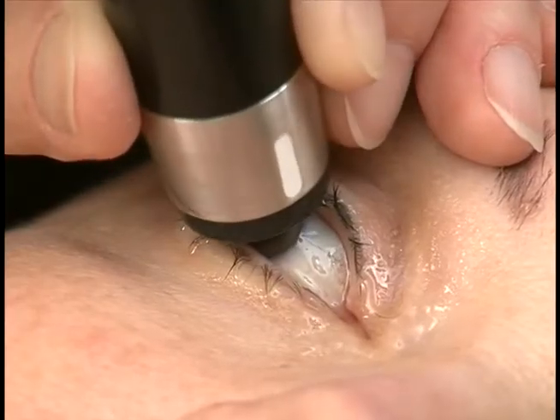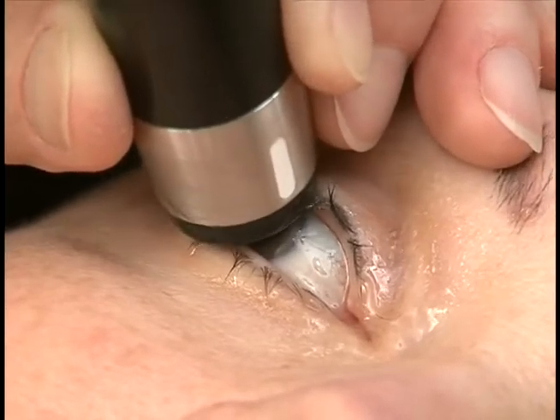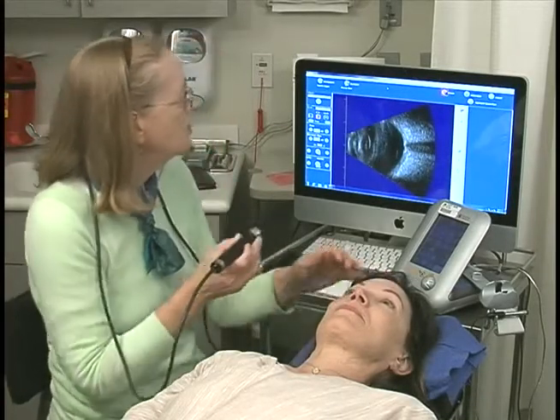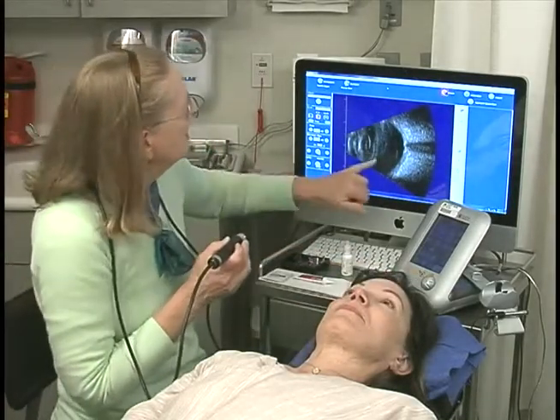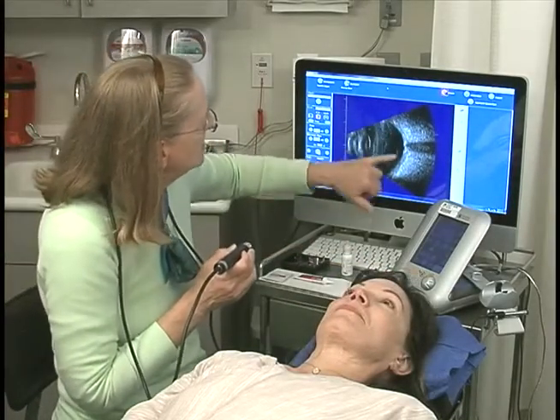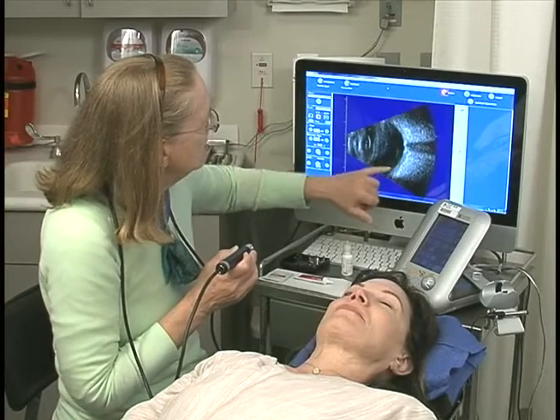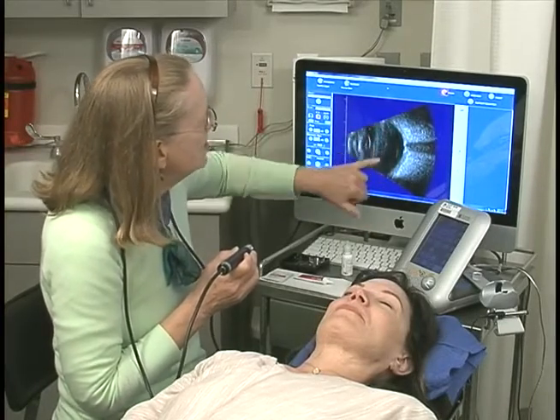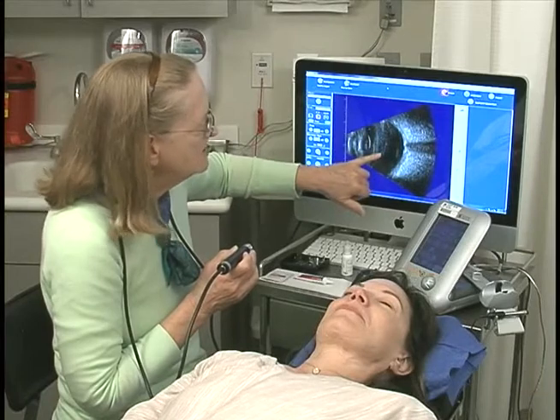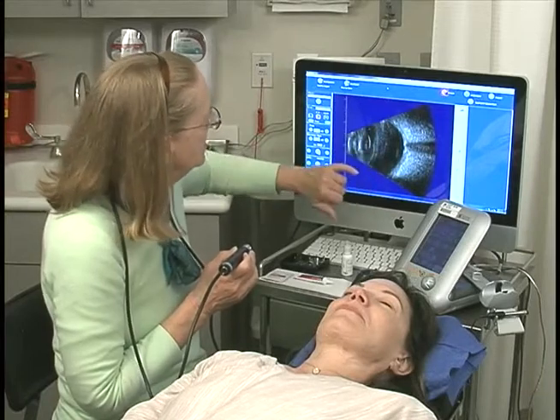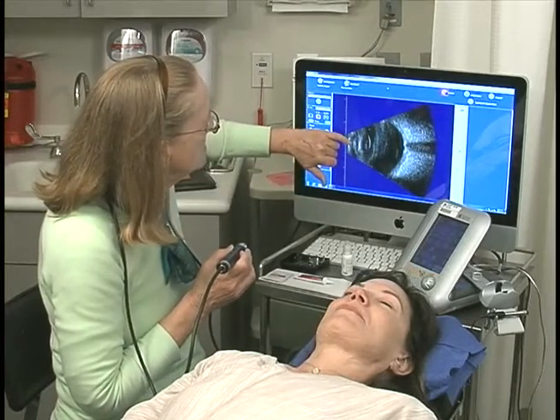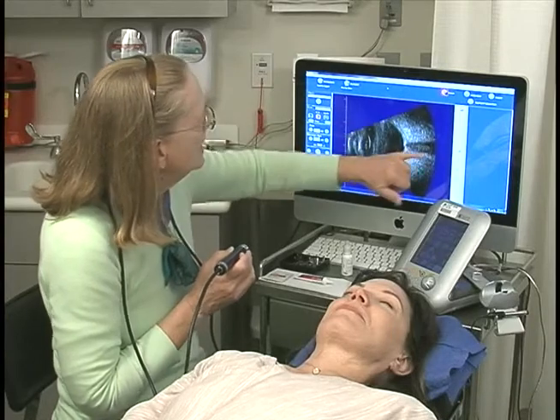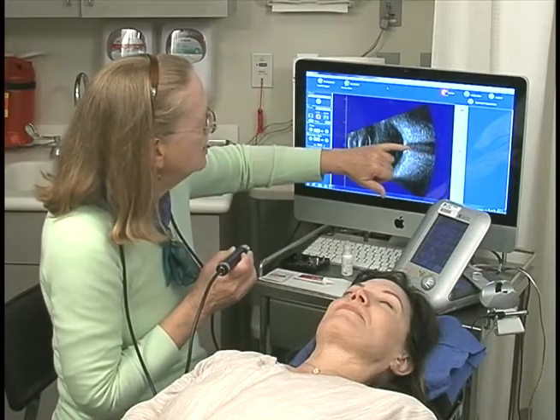And now when I get the optic nerve — there we go. I'm going to freeze that for a moment just to show you that you have some aberrations here from scanning through the crystalline lens. Lots of artifact — that's not something in her vitreous. We can actually see the anterior and posterior cornea and optic nerve.